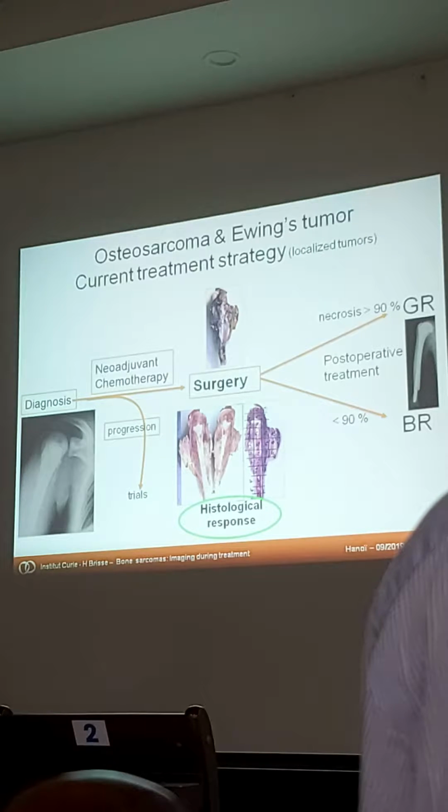So, what is the role of imaging in this period? During the first period, during treatment, the most important question is asked by the pediatricians. They want to know if the patient is going in the direction of tumor response, or if the tumor is non-sensitive to chemotherapy, so they would refer the patient to another second-line treatment. So the question for us is to say, is there a disease progression during this treatment or not?